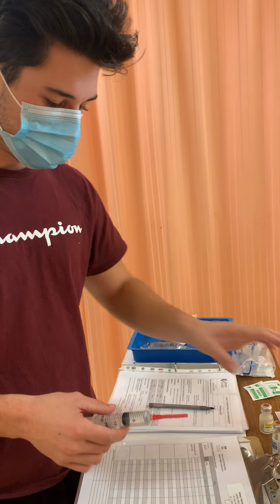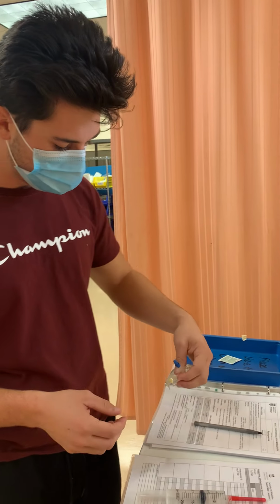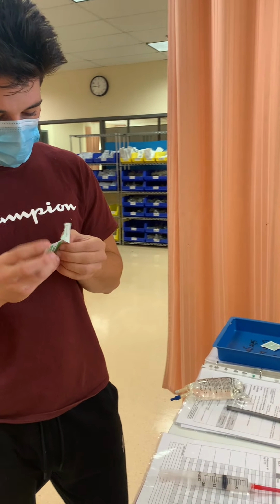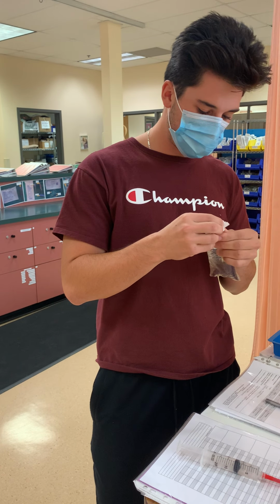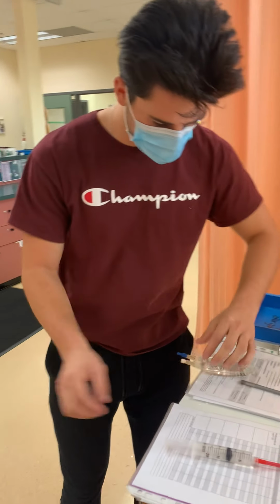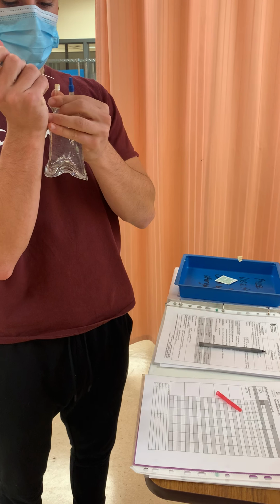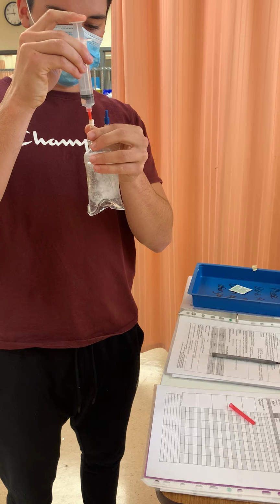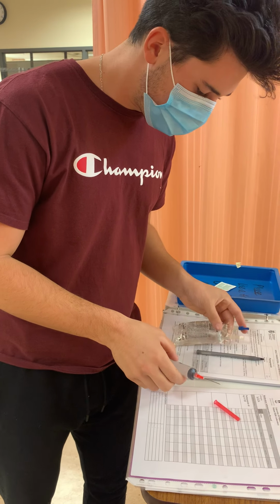So then, once I've done my second check, I can go ahead and dilute it into my piggyback med. So I can start off by swabbing the top of my port. So I'm going to swab the top of my port for 30 seconds, let dry for 15. And then I'm going to just set it down sterilely, making sure it's not touching anything. I can uncap my syringe, and then I can go ahead and inject my medication. So once my medication is injected, I can go ahead and just set this down.